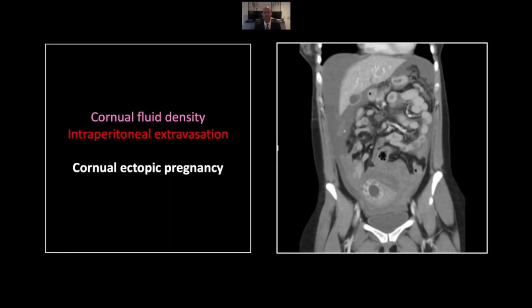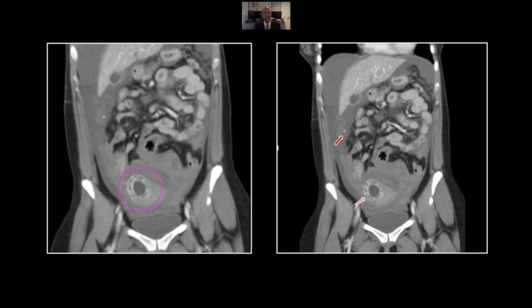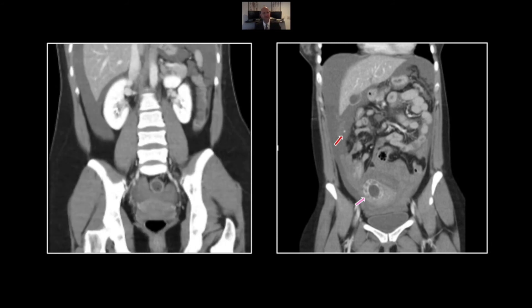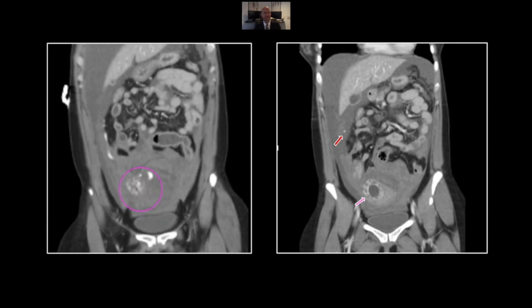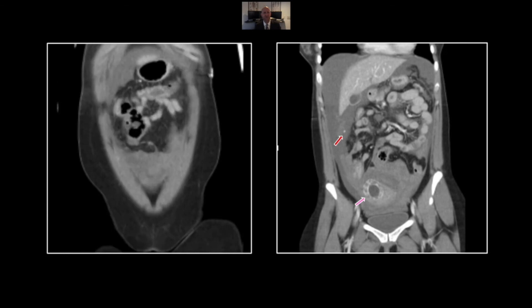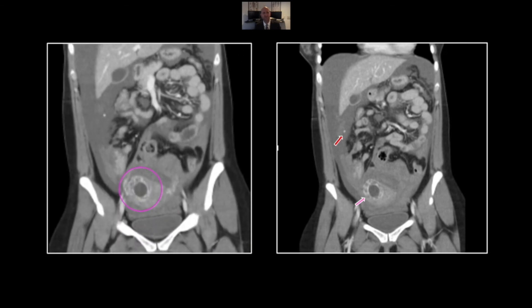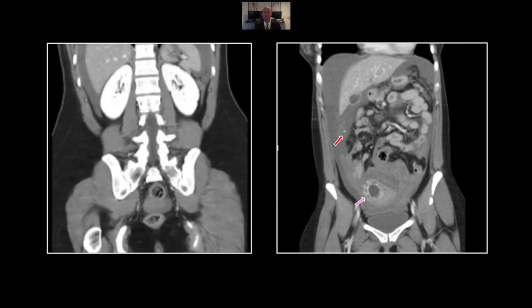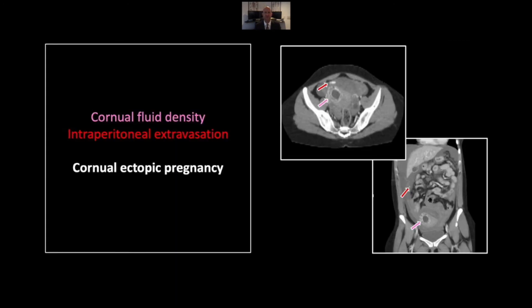On the coronal view, you can really appreciate the cornual location of that gestational sac. There is also active extravasation you can appreciate throughout the abdomen. As that extravasation winds its way through the intraperitoneal clot, it looks almost like a vessel — a fairly common appearance of ongoing intraperitoneal hemorrhage. That is a cornual ectopic pregnancy, a surgical emergency with clear intraperitoneal hemorrhage.